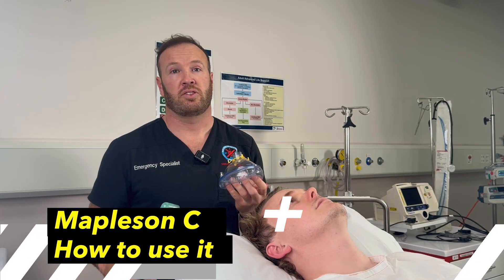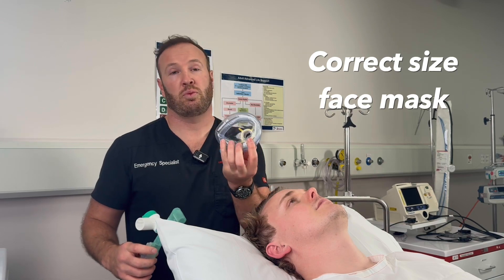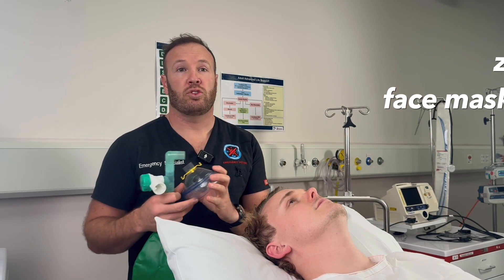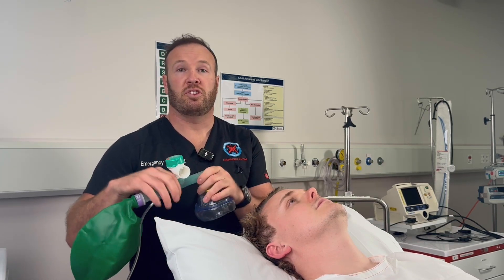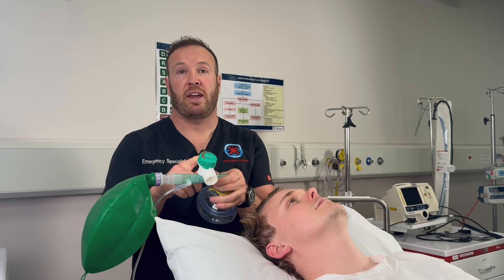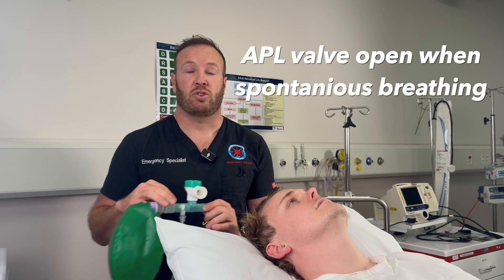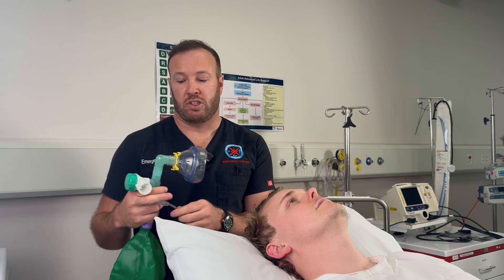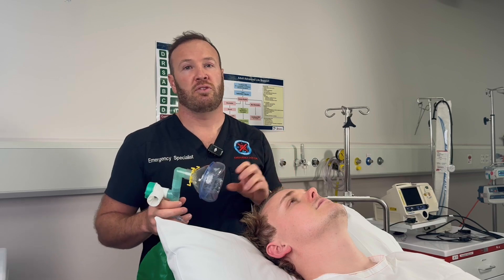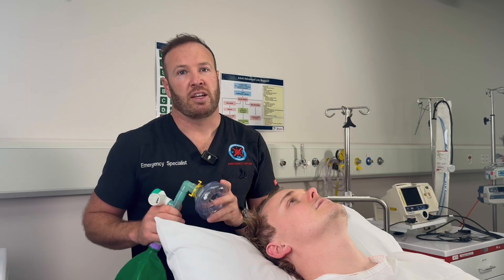Now let's look at how we use this. The first thing we need to do is choose an appropriately sized face mask. It comes with its own face masks with a rubber flange, or if you have one you prefer — such as one with an inflatable cuff — you can use that. I'd also advise trying to put a viral filter and an end-tidal CO2 monitor in between the mask and the Mapleson circuit. For the spontaneously breathing patient, start with the APL valve completely open and set an appropriate fresh gas flow. An appropriate amount is twice the patient's minute ventilation — for a normal patient that's about four to five litres per minute, so we're looking at wall oxygen of somewhere between eight and ten litres per minute. If your patient has an increased respiratory rate, you may want to increase that further depending on the clinical situation.